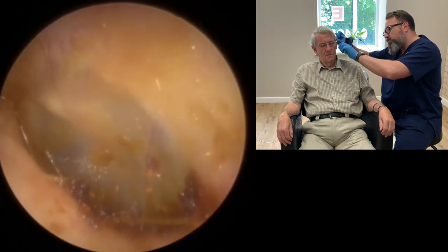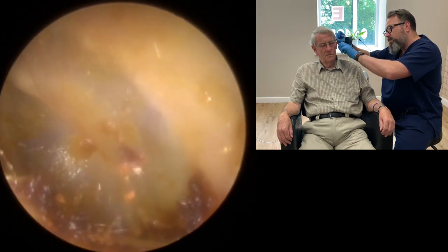Okay, so it's looking a lot better in there now. Just got a few little pieces there. I can see the eardrum, it looks good. There's a little tiny bit of wax on the ridge just in front of the eardrum, so I'm just gonna try and take some of that away.